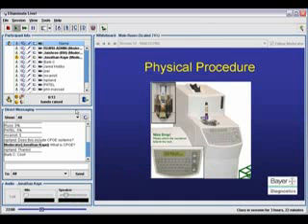Now, that's a type of physical procedure. You're not going to teach someone how it feels to hold a vacutainer or how to put something together from a tactile sense, but you're going to give them that familiarity so that the newness of holding and touching things at least is something that they're not going to get confused by, as well as operationally what they have to do.